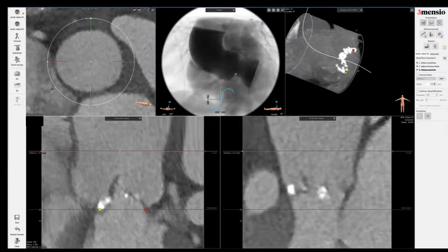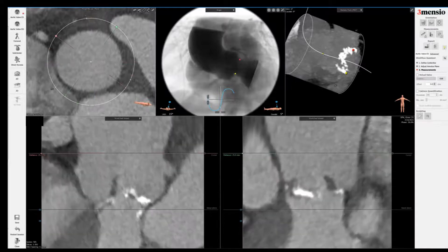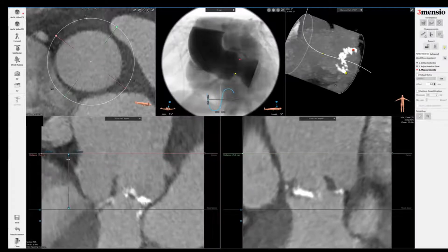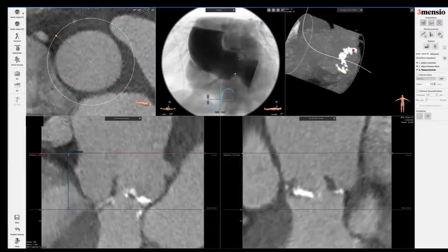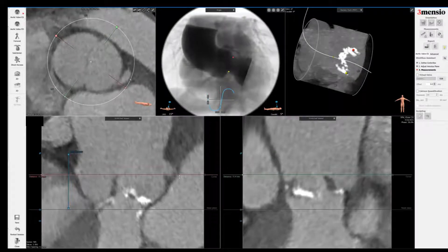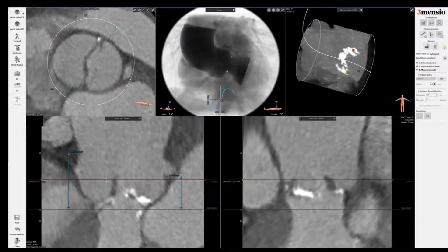Next, I'm going to go to the sinotubular junction. You can see here the sinotubular junction is very effaced — it's hard to even tell where it is. But when you spin around, you can see where the left main takeoff is, so roughly right above that. I label it with right-click and select sinosal view. Using the ruler times two tool, you get the sinotubular junction dimensions. I right-click to label that, then come down to show the left main height and your sinuses of Valsalva dimensions.